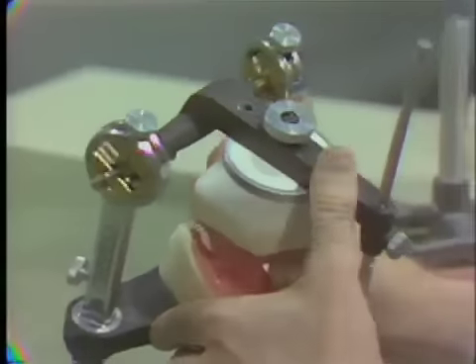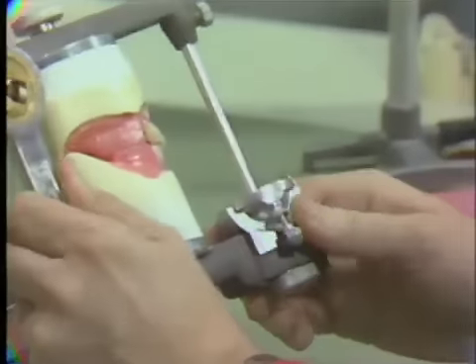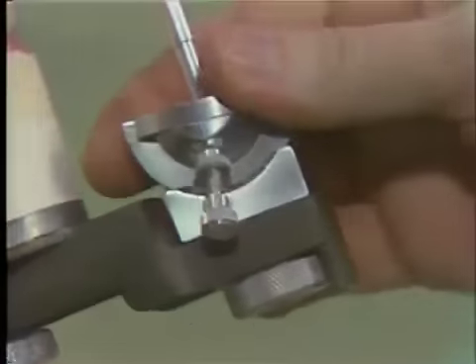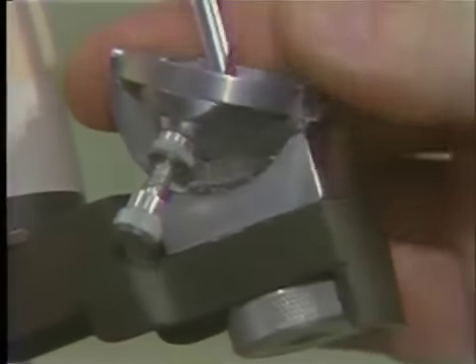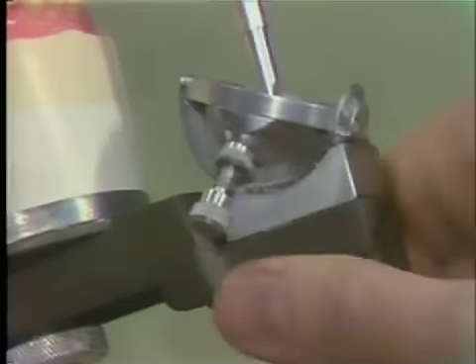Now we have to pay some attention also to the incisal guidance. The manufacturer's specification for this tooth — the Pilkington Turner tooth — calls for a 30 degree incisal guidance. So let's set that at 30 degrees and once again tighten it down.